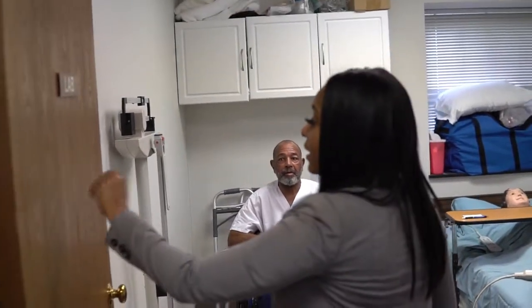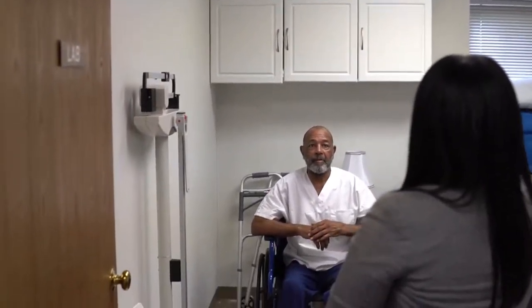As always, you want to knock your way in. Hi Mr. Bailey, I'm Fern. I'm going to be your nurse aide. May I come in? I'm going to wash my hands.